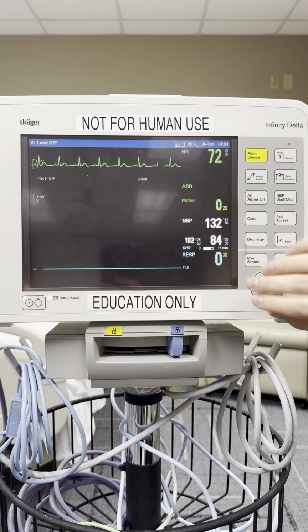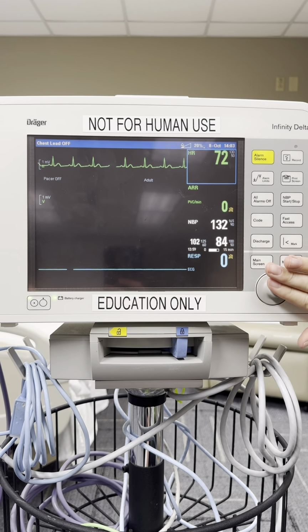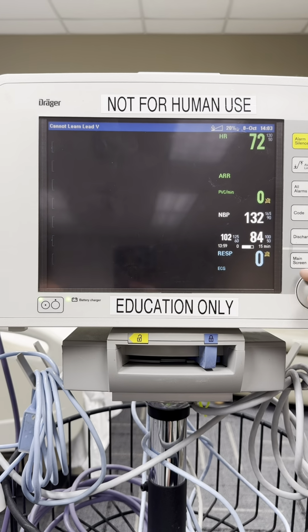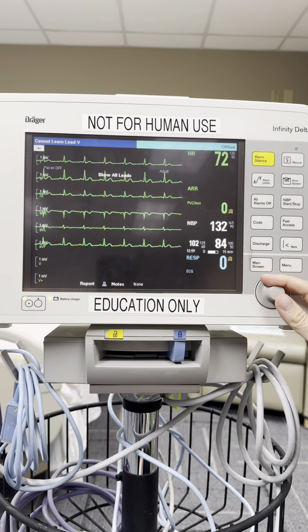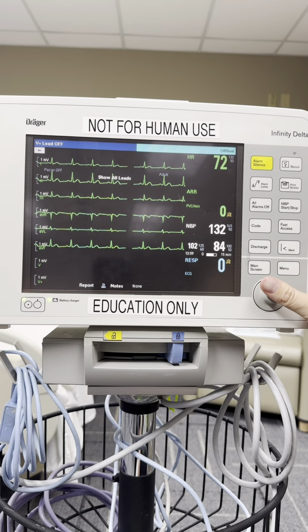Next, we'll just go through each of our different options here. If we highlight the heart rate box and click that, you can show all leads. This is helpful to see if the arrhythmia is in one lead, if there's ST elevation in more than one lead. Helpful to just pull up at the bedside.